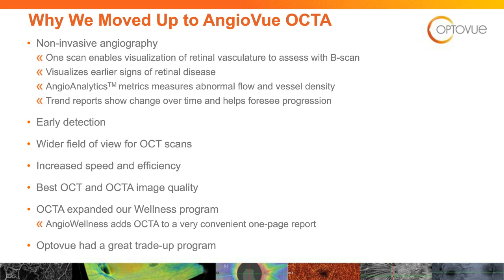Our traditional OCT was great for glaucoma, great for diabetic changes in the B scan, and awesome for the vitreoretinal interface. But traditional OCTs were pretty much meh for macular degeneration.